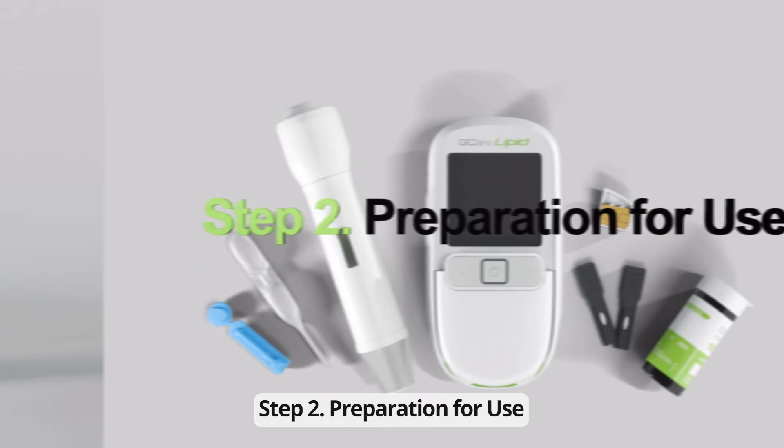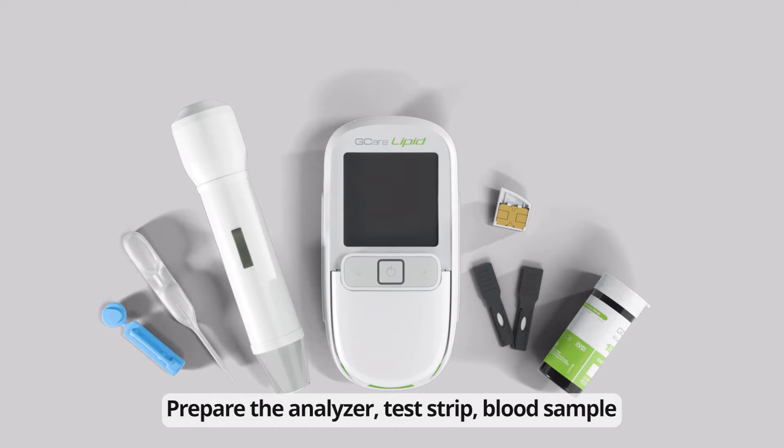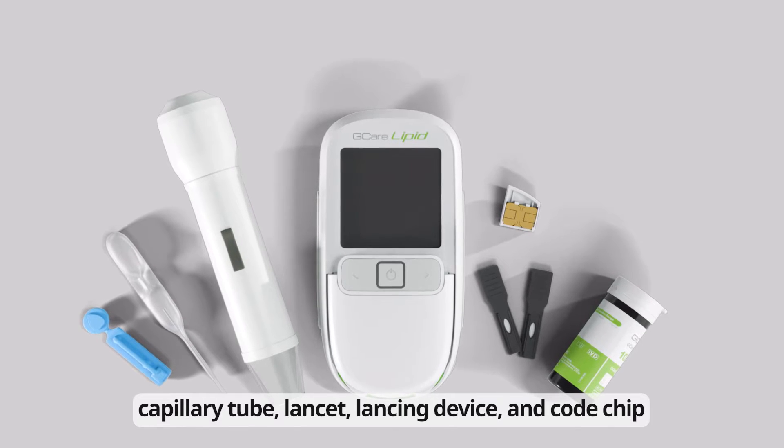Step 2: Preparation for Use. Prepare the analyzer, test strip, blood sample, capillary tube, lancet, Lancing Device, and code chip.